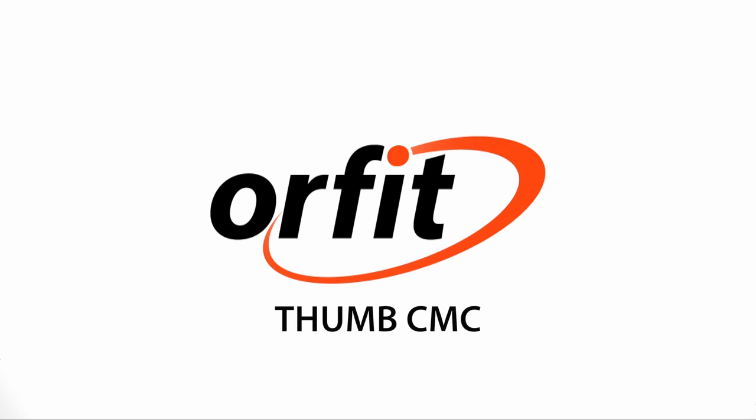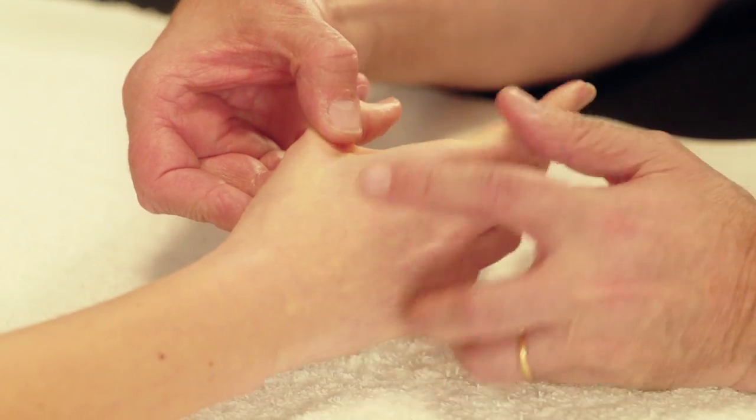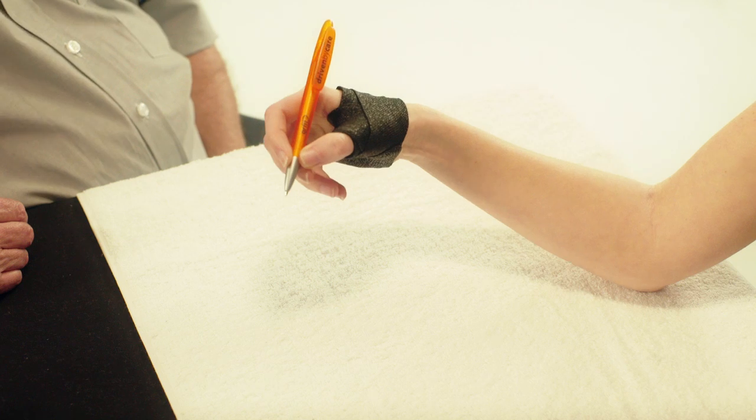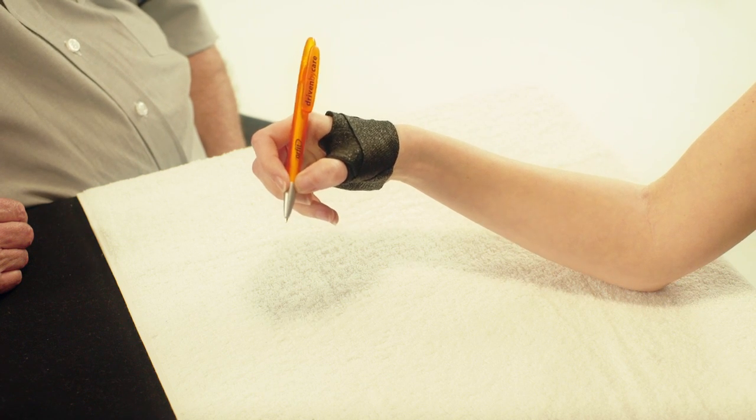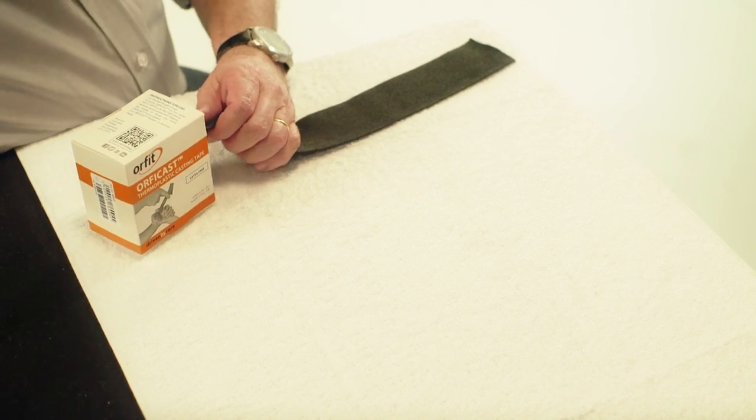Thumb CMC. Here we will demonstrate how to make an immobilization orthosis for the Thumb CMC. Use a strip of Orphicast that is about 40 cm long and 6 cm wide.